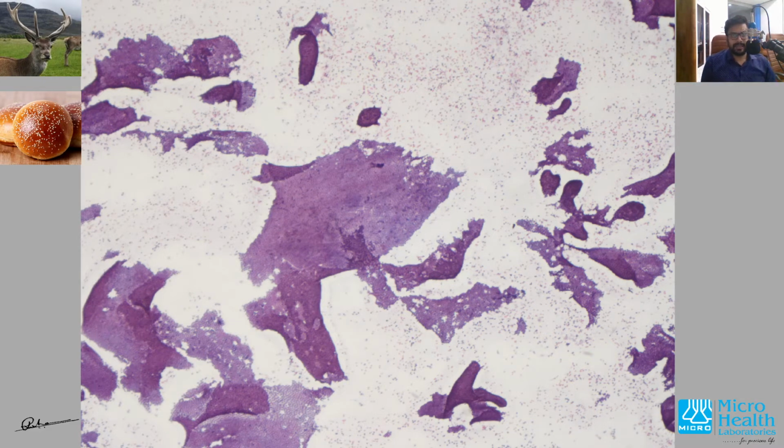What you're seeing is an aspirate which is smeared onto a slide and stained with Pap stain. So what you're seeing is basically a lot of cells. You have to correlate the age and the kind of cellularity that we are seeing. Usually, when the smear is very cellular, we think about a malignancy.